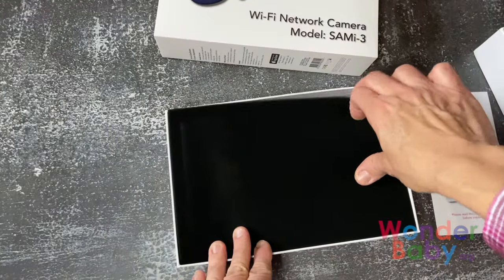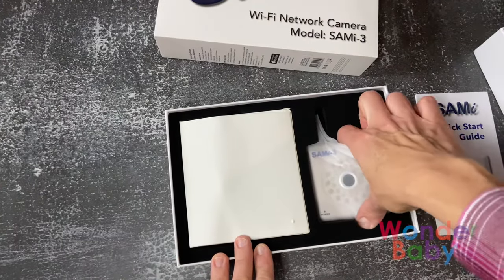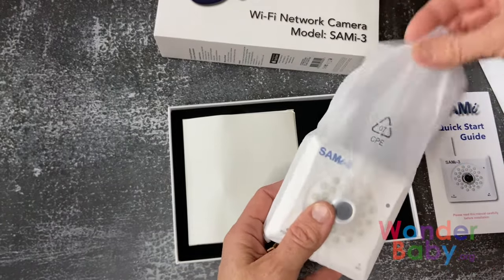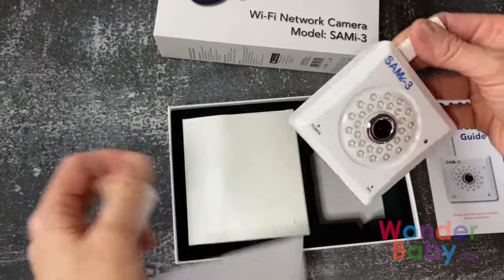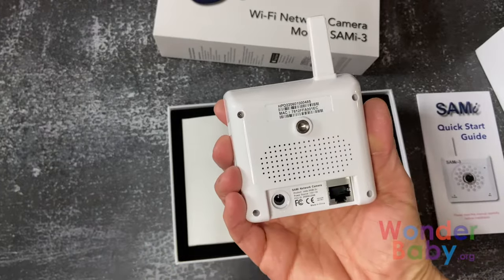Getting into the box, we are going to get the camera. This is the SAMI 3 camera. It's a nice size — not too big, not too small. It does have some lights on the front that you will see when you set up the monitor.